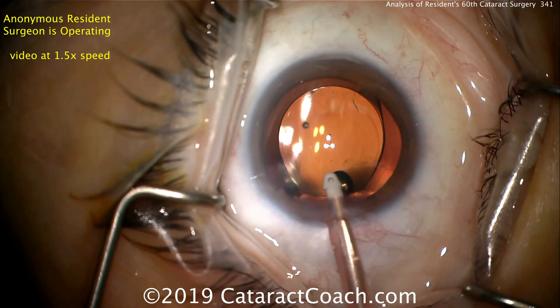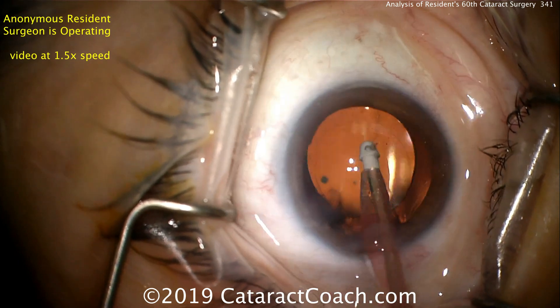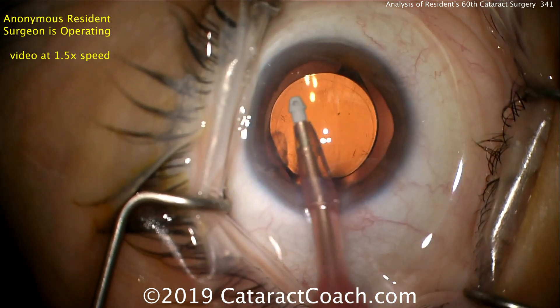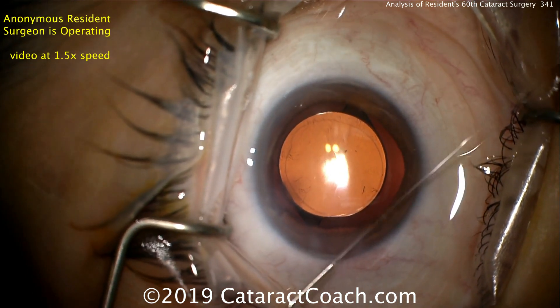There you see the overlap is quite good — very nice. Removing viscoelastic here, and then just tilting the lens in various areas to get all the viscoelastic out. Later on, as this resident gets better, we're going to go behind the IOL to remove viscoelastic from behind the optic — that'll be important for a toric lens to help keep it in good position.